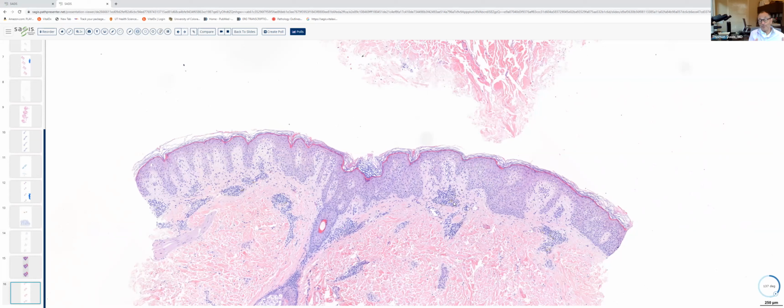That being said, sometimes you can get drug-induced EM where you can see a few eosinophils. And in those instances, differential is pretty much based on history and clinical findings.